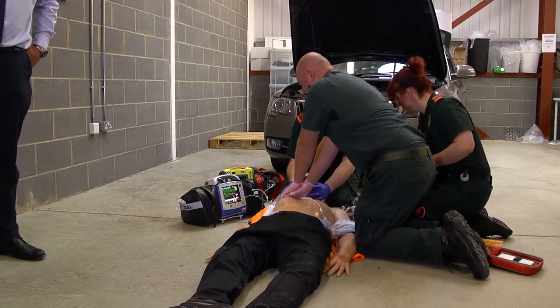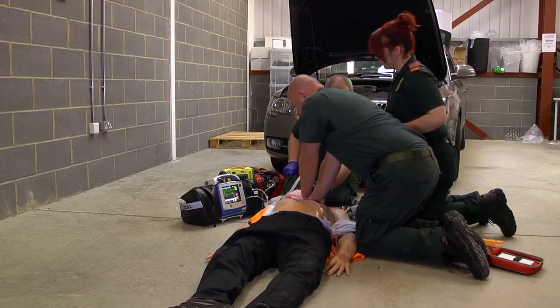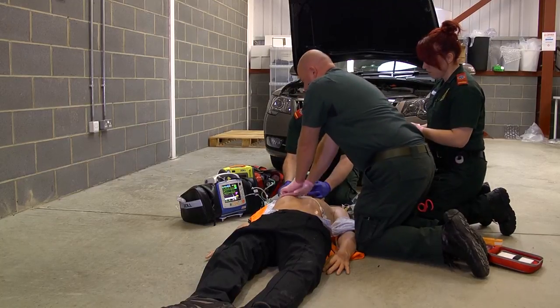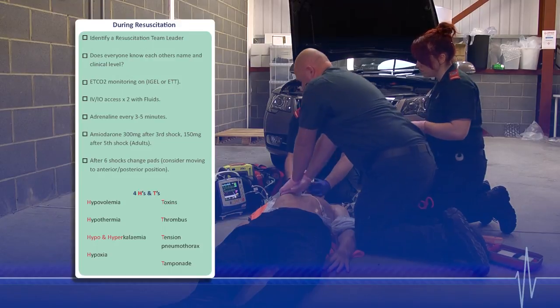Okay, so that's a good one. Excellent. Andy, how are you doing? Do you need a break? No, I'm fine. I'm getting good quality CPR from the screen. Right, do you want me to see it? Okay. Yes, Sean, if I give you the checklist, would you like to start and run through the reversible causes? Checklists are important, ensuring that nothing is missed.